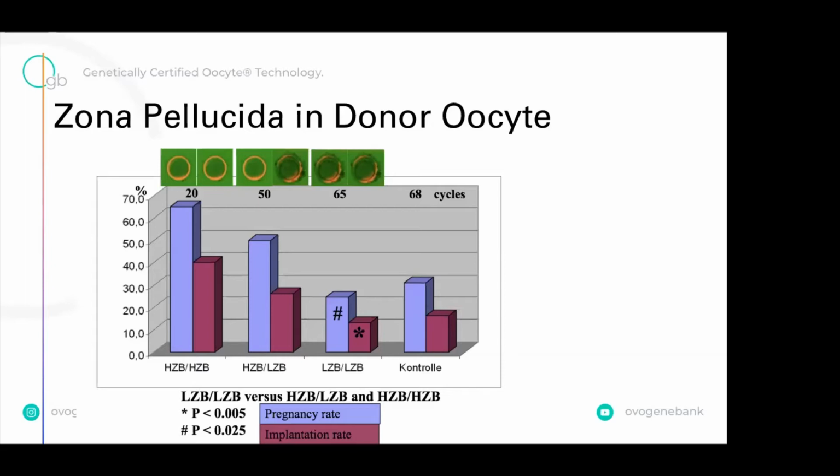But when we have very low Zona pellucida thickness because of the thawing quality, and this is a traumatic method, when you thaw the oocyte the thickness of the Zona pellucida gets lower, and it directly affects your fertilization rate. Mostly you may find degenerated oocytes after ICSI. You may also find high fragmentation rate, which is directly connected with the thickness of the Zona pellucida.